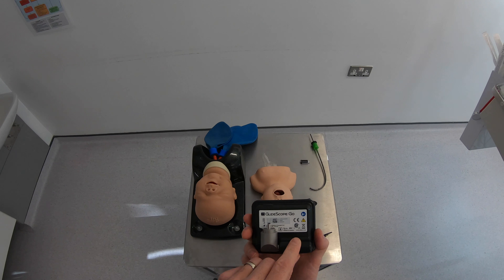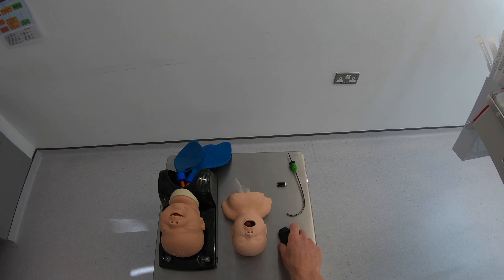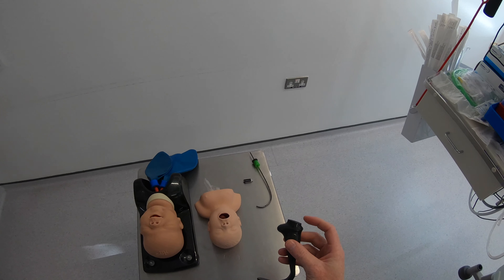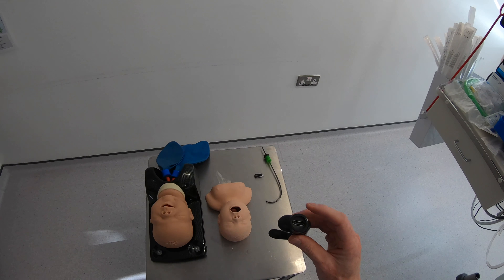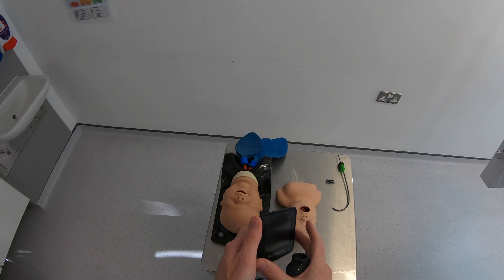Today I want to have a look at the Glidoscope Go. This is a new portable monitor by Glidoscope. It's pretty small and compact and it's designed to be used with the titanium spectrum single-use blades.